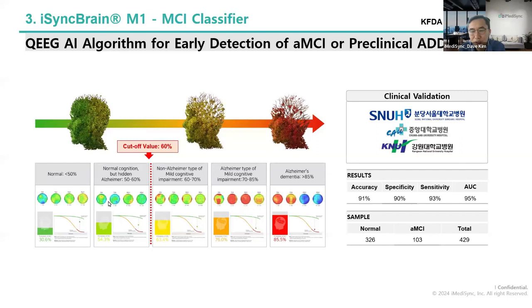Yes. About this data of MCI, we also have some problem when we are explaining this result to patients, because the number, 50% or 75% or 20%, we cannot see what it really means for their symptom.